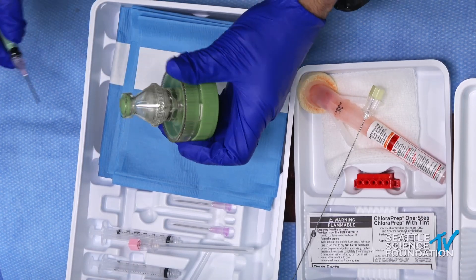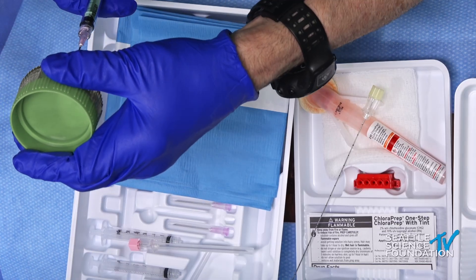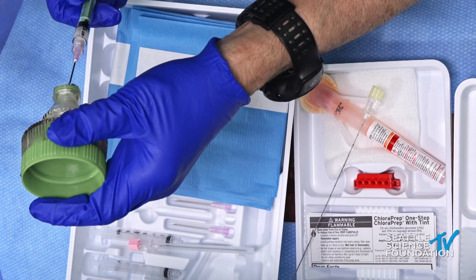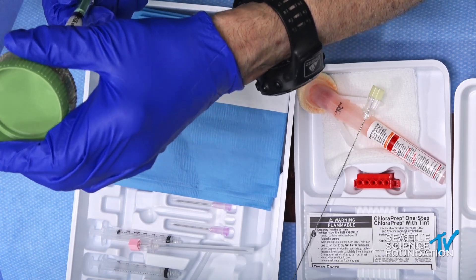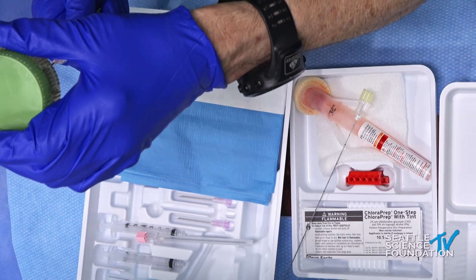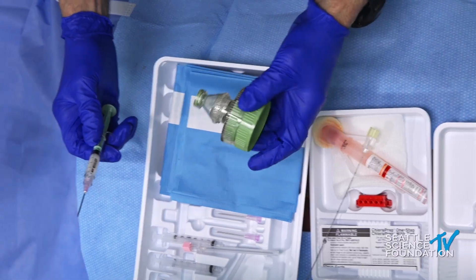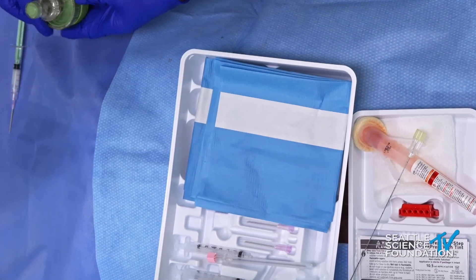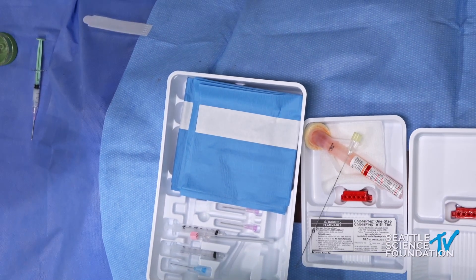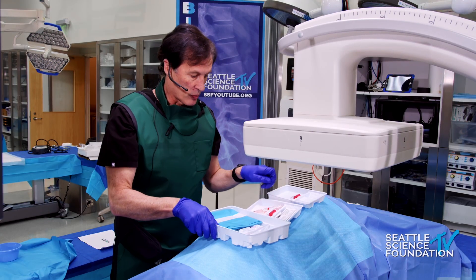Once it's mixed, we're going to draw it back up within the same sterile syringe. We have a little over two cc's of material to inject into the lumbar spine. I'm going to put that to the side for a second.